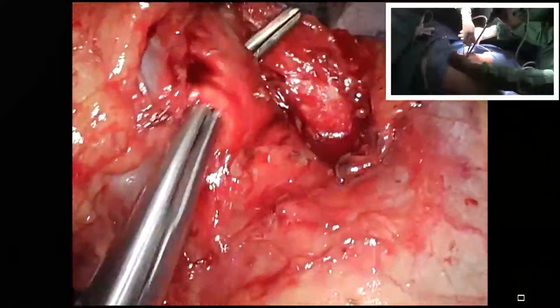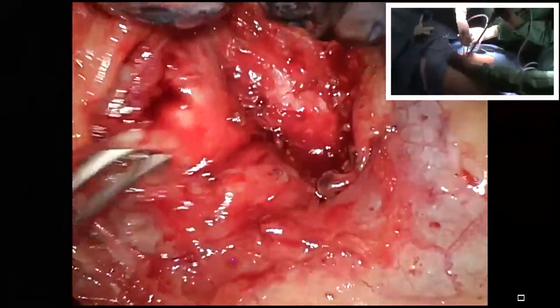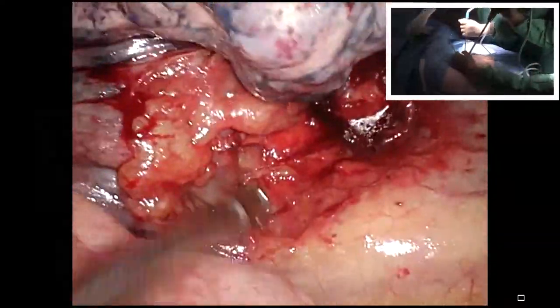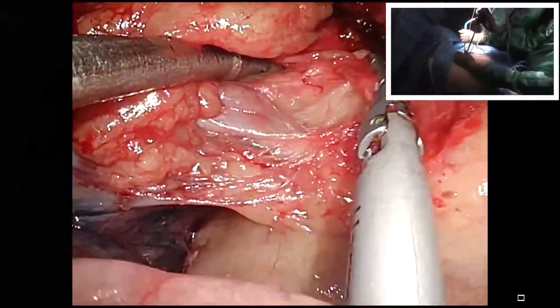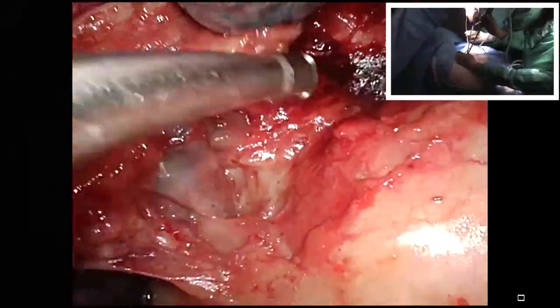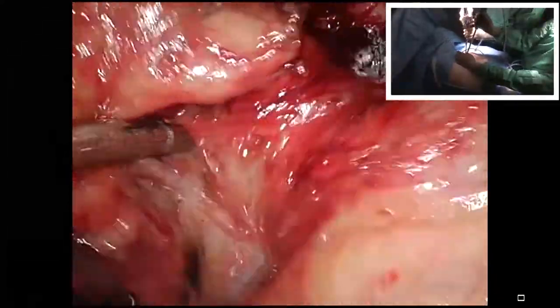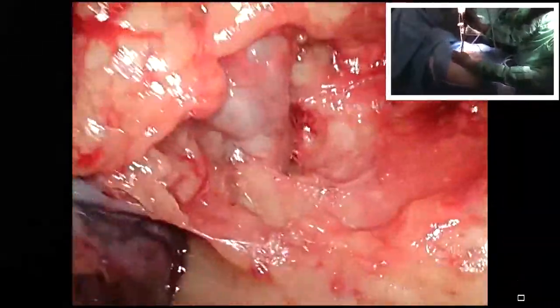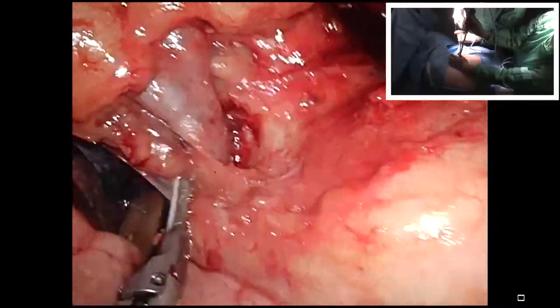So Bernard, yesterday we saw some video material which some of you also presented for the difficult cases. In every case, to have the approach to the central part of the pulmonary artery first, before, maybe in difficult cases, Diego also showed to cut the bronchus if that is questionable. If you are in doubt what is behind by dissecting the arterial interlobar portion, it would be clearly recommended to be upstairs first. This is not that case. Therefore it's checking for the main artery, just to be sure we are cutting.